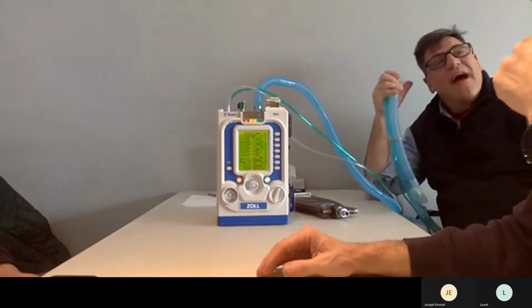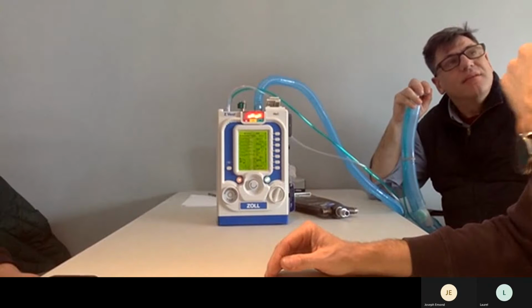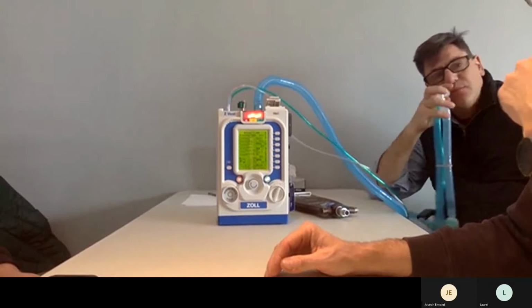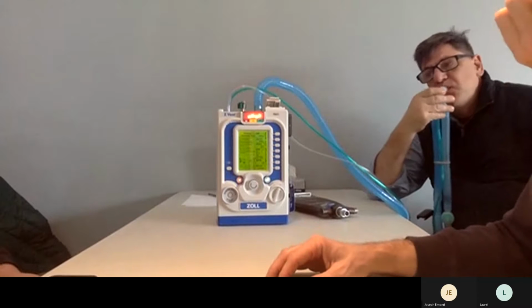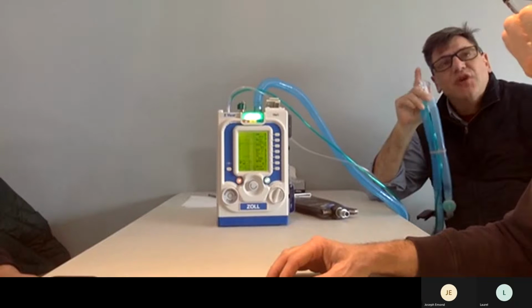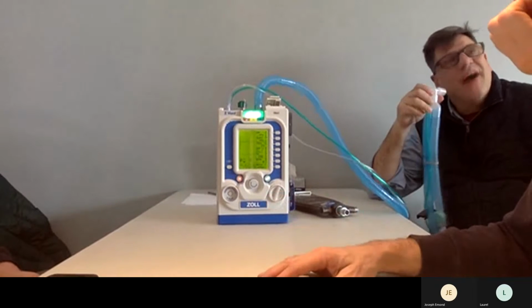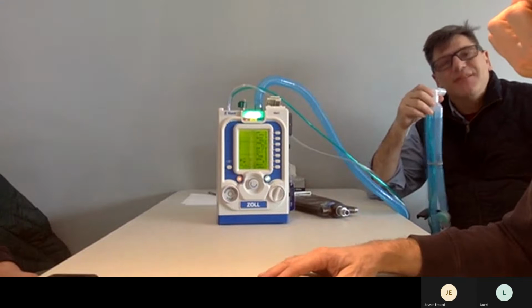Now, it does have an apnea backup alarm. It will switch to AC mode. Okay, that's what I was going to ask, if you have apnea, it'll switch. Now, I do have to be clear: you are not good at what you do if you show up at the hospital for an apnea backup alarm. It is not a definitive airway, right? Don't do that.